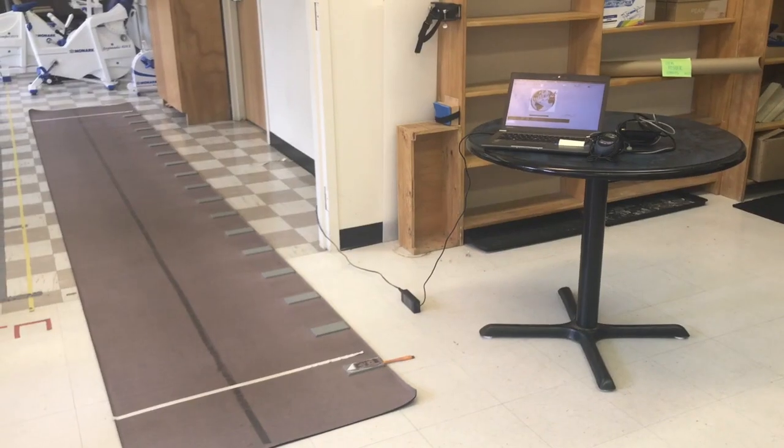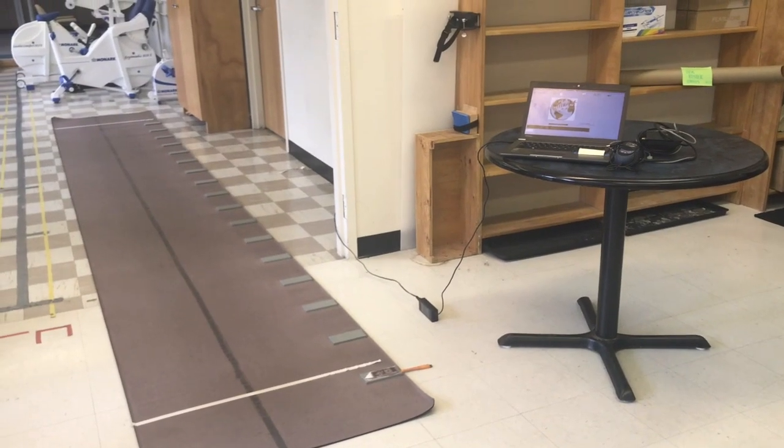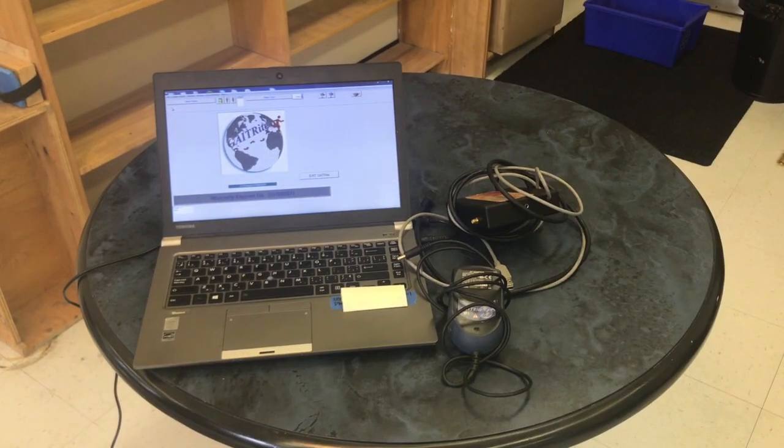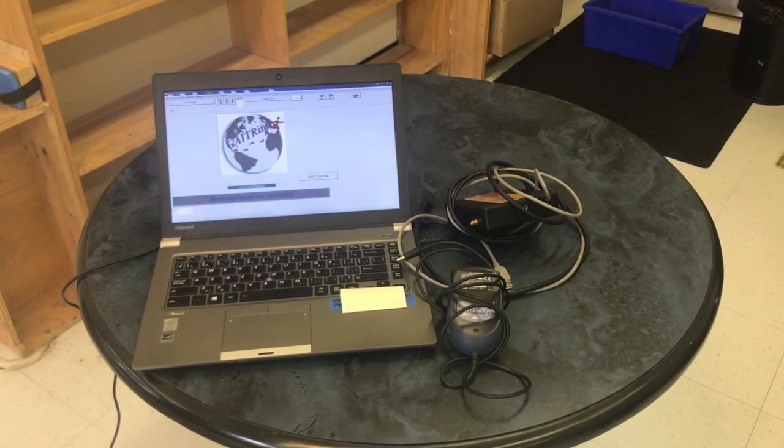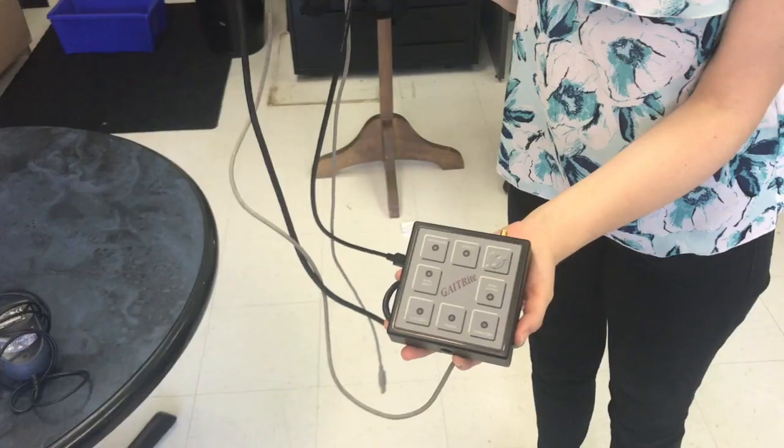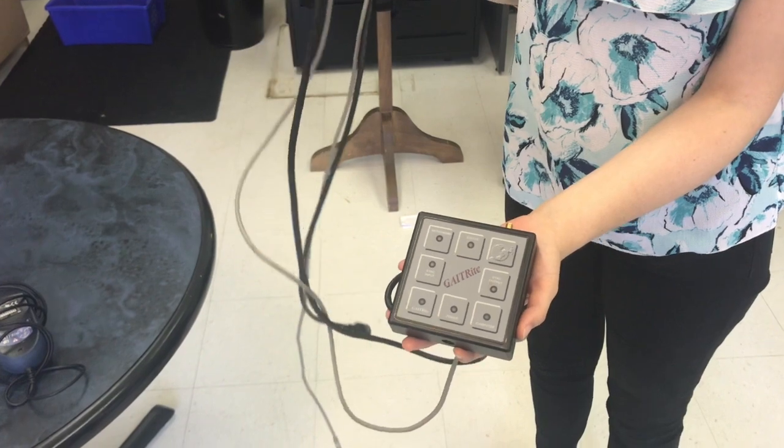GAITRite setup. You will need a GAITRite, a computer with GAITRite software on it, and a large enough space with access to an outlet to plug the GAITRite in.